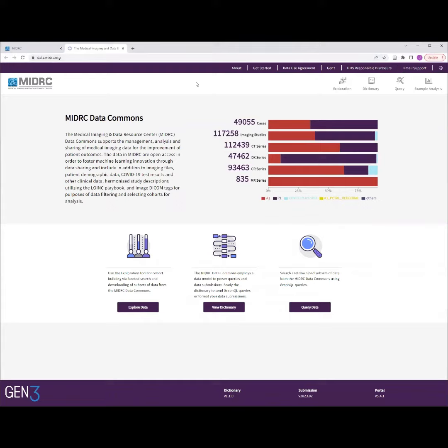Hello, and welcome to this demonstration of the MIDRC Data Portal at data.midrc.org.